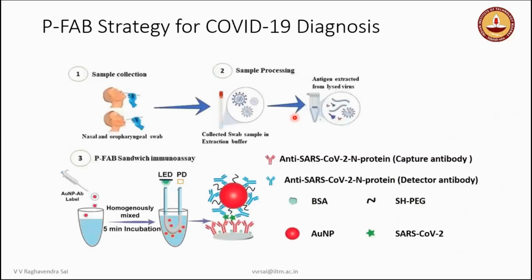So coming to COVID, you all know, and we all forgot about COVID, thanks. However, we really made a lot of progress, and a lot of good understanding we have developed over those years. Whenever we have such kinds of respiratory infections, one can access the sample through the nasal or oral regions. So get the swabs, simply dip them in extraction buffer, and you have the virus lysed, and then protein comes out into the solution. So you don't need to pre-process the sample. You just use it like that.